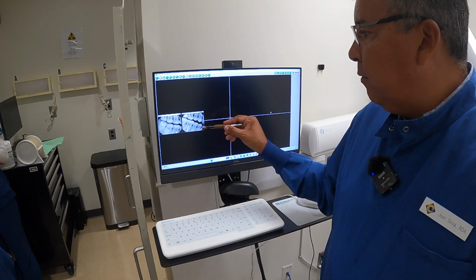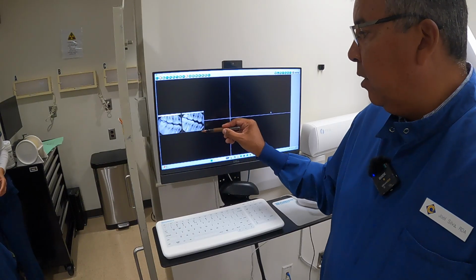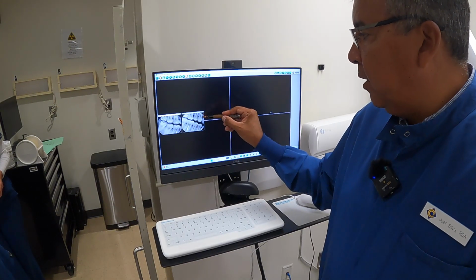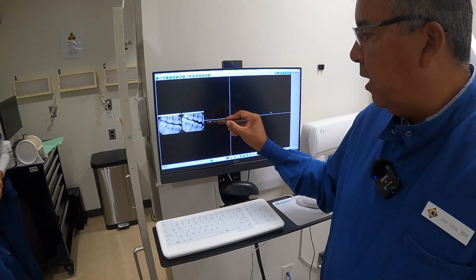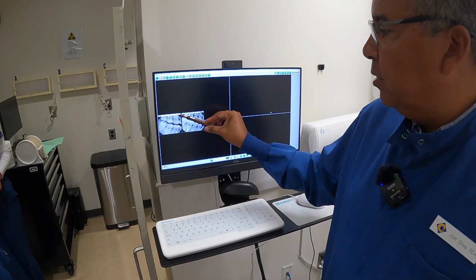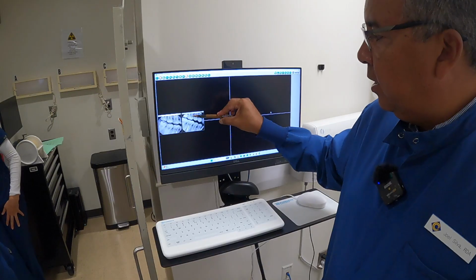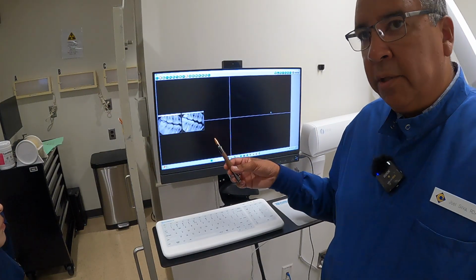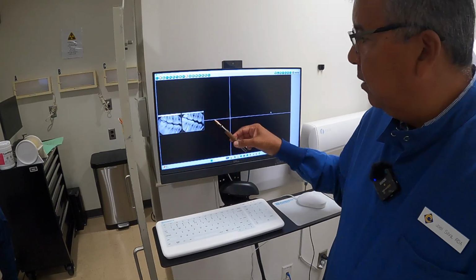What we're also looking for is the bone that supports these teeth in the area that we're looking for. Can I see the bone between here and here? Yeah, the bone is supported. I can see it right there, right there, right there. I'm not worried about what's coming in front of that canine. I just want to let you know. Now this is a little bit off. My margin got a little bit turned. Generally, I'm hoping to do this, but because all that area that I need is still there, it's still a diagnostic quality film, okay? Small error, but we get to see what we want to see in there.